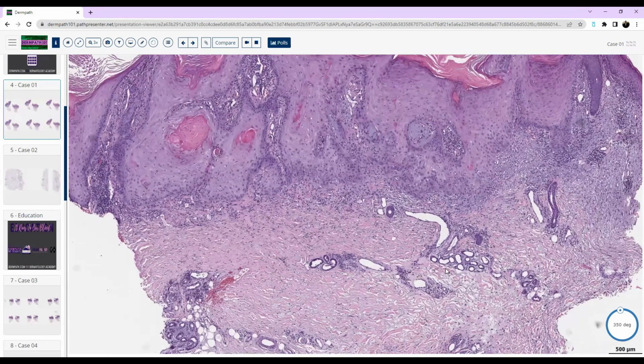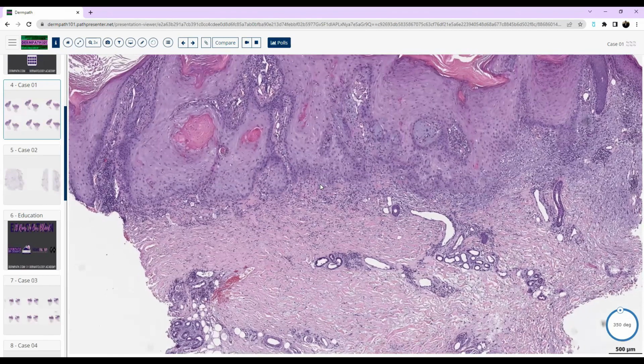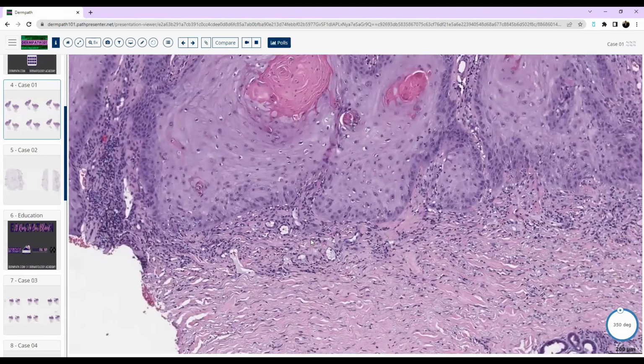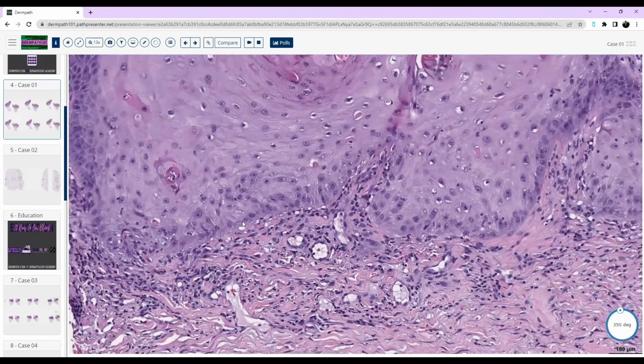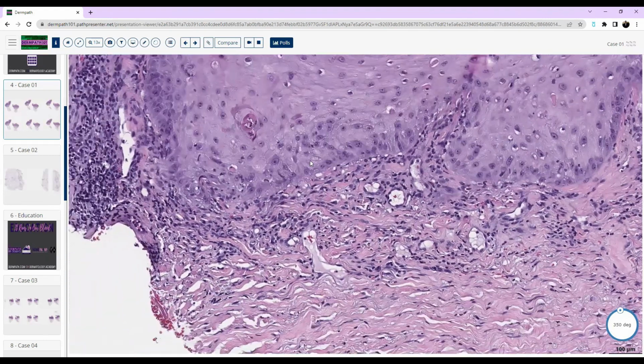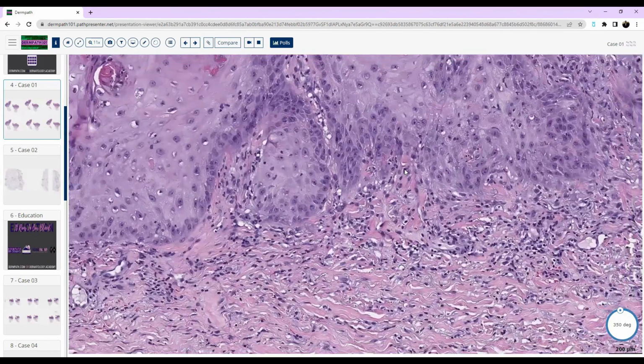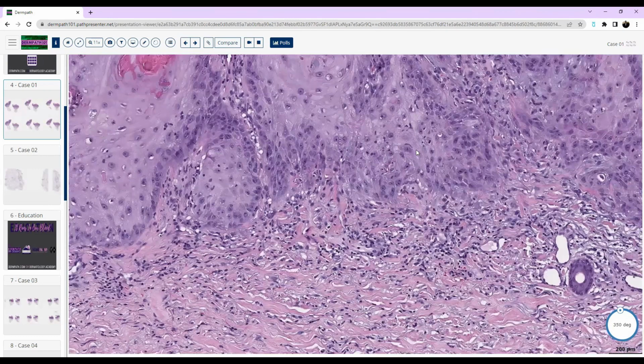I was trying to figure out what it would be in this case. I know, like in granuloma fissuratum, depending on the right clinical location, sometimes you can find that, like from rubbing from eyeglasses. Sometimes you'll see it in infections. So I know chromoblastomycosis can have it, but I didn't see any of the copper penny spores.